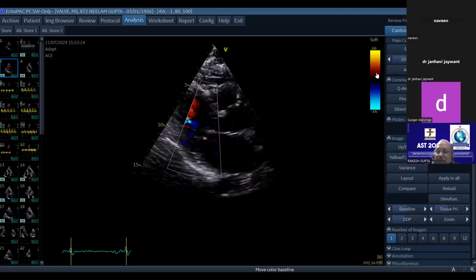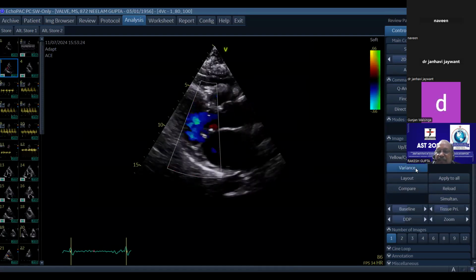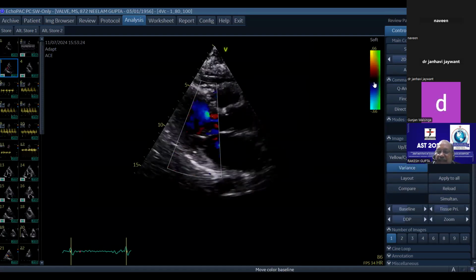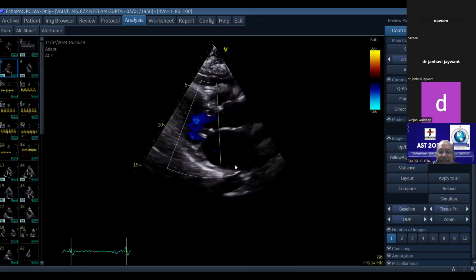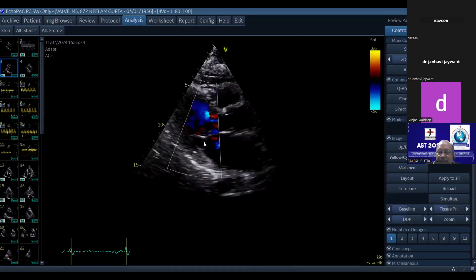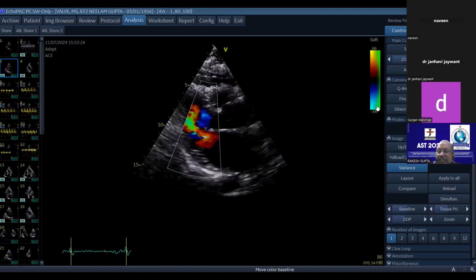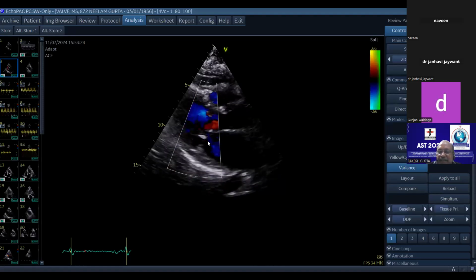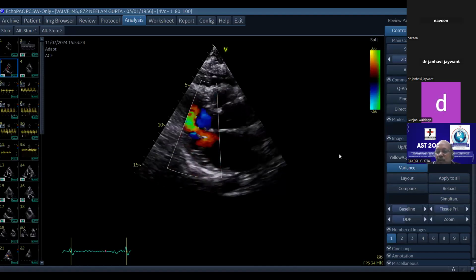In some maps you will see only red, only blue. Now I'm changing to variance map. There's a button; I switched over my map. Now look at this color flow. As soon as I change to variance map, I could see the same thing, but a better color flow. It all depends what kind of map you are tuned to.